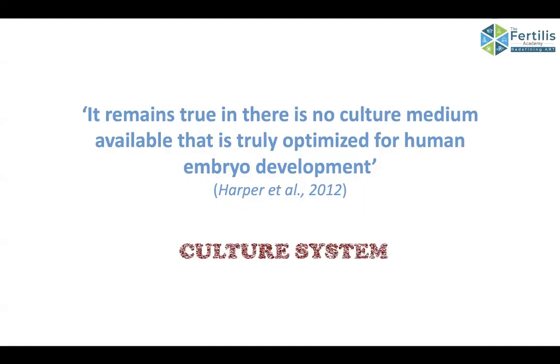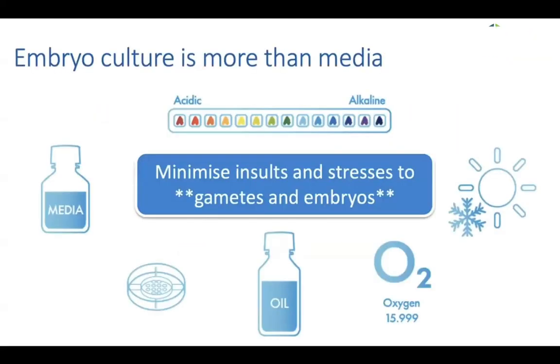Now I would like to introduce the concept of a broader culture system, and we'll move ahead of culture media. The culture media alone cannot sustain, like Surya said in the beginning, it's not only about culture media, it's about the culture system as a whole, and the culture system includes culture media, which is an important but tiny component of the culture system as a whole.